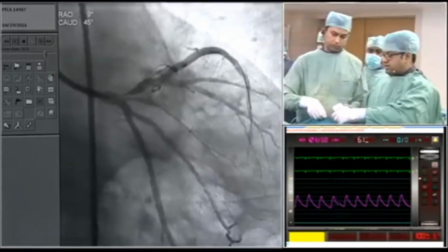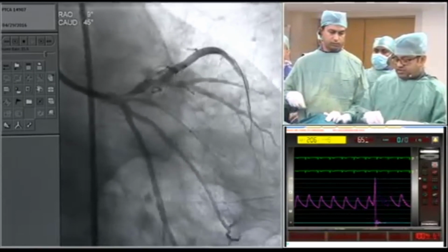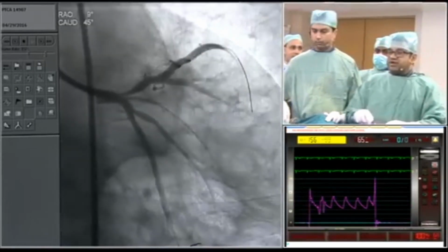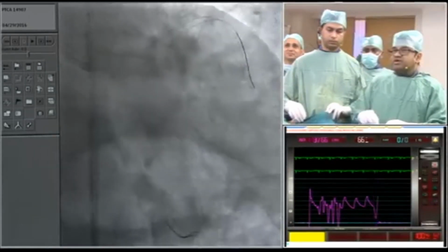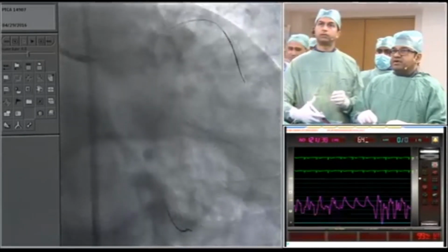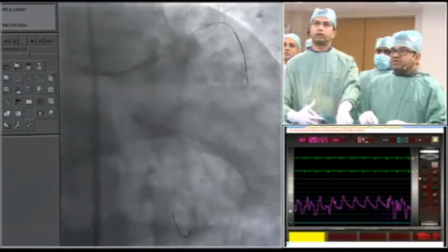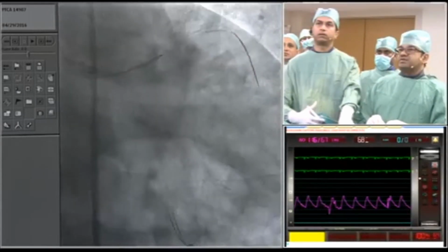So this is a time-tested stent from Meril Life Sciences. We have used more than 3,000 stents of this BioMime Aura, and the long-term results are very good and proven. Since it's a left main, I think we would prefer a metallic DES, because there is no issue of future use for the stent, such as the bypass graft site.